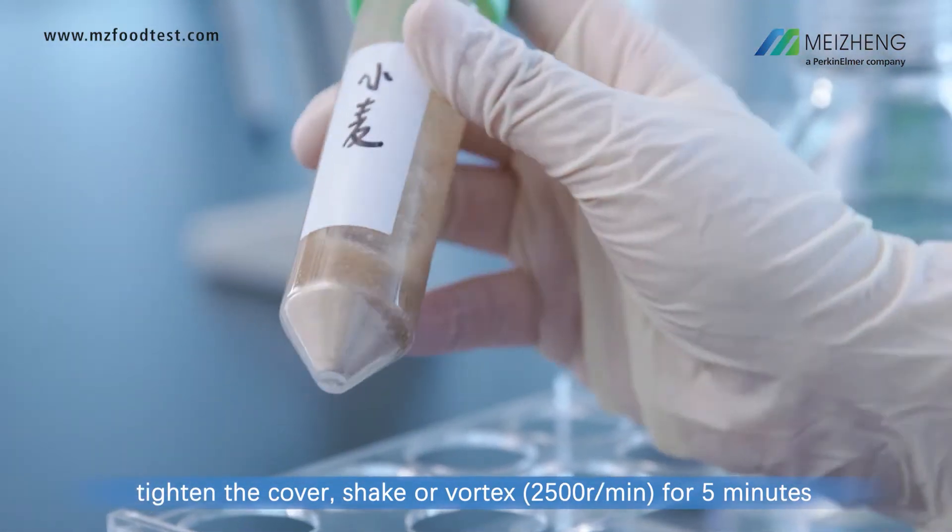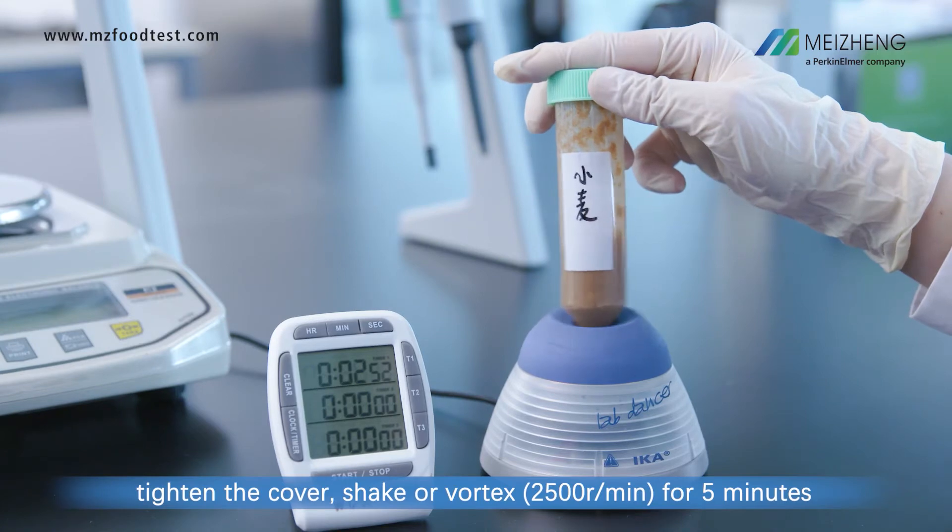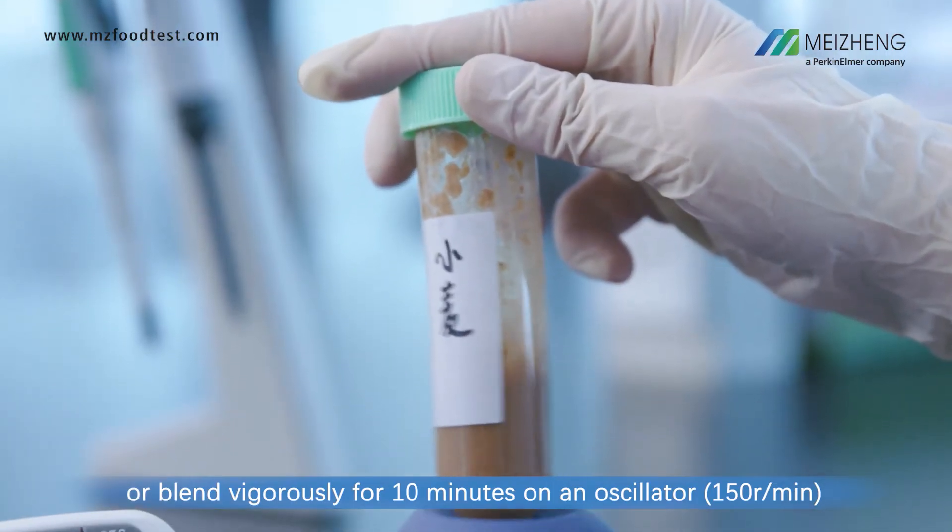Shake or vortex for 5 minutes, or blend vigorously for 10 minutes on an oscillator.